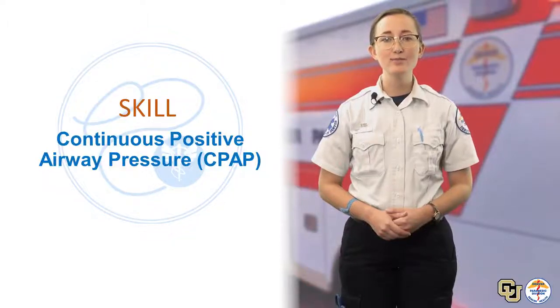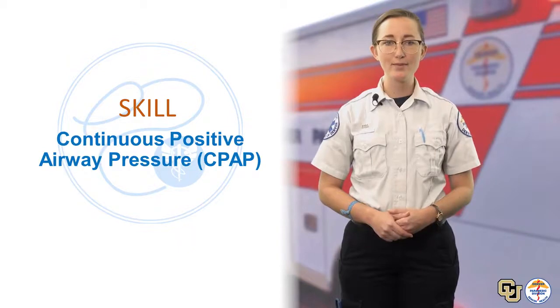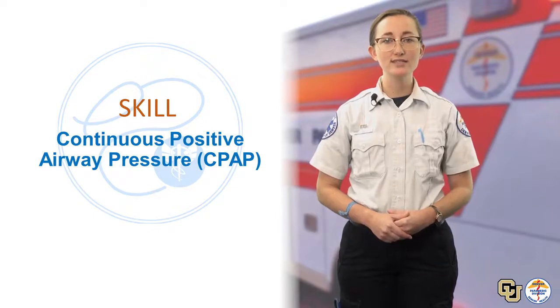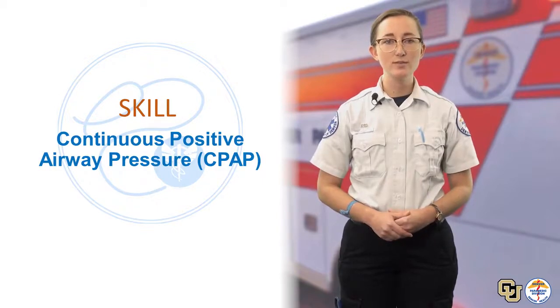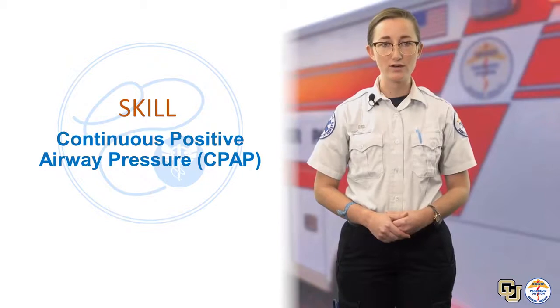Advanced providers sometimes use a continuous positive airway pressure device, commonly known as CPAP, when managing patients with moderate to severe respiratory distress. This is an advanced skill that you might find yourself assisting with as an EMT, so we will cover it here. These patients will generally present with tachypnea and use of accessory muscles along with other signs and symptoms consistent with asthma, COPD, or heart failure.